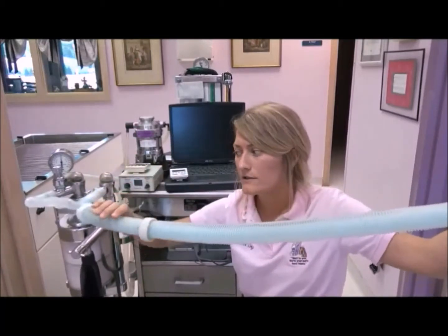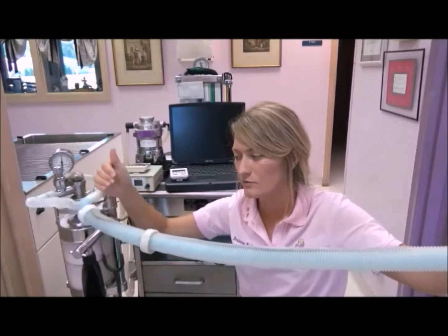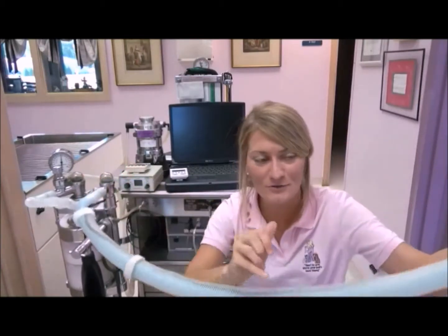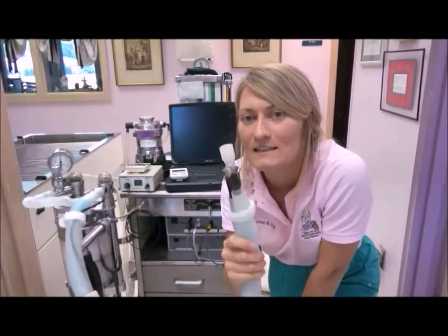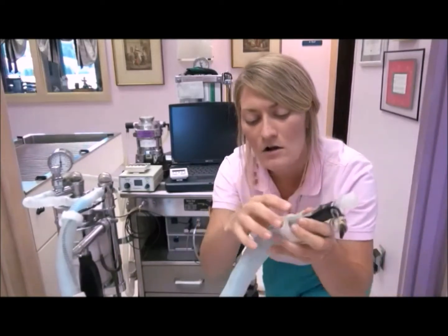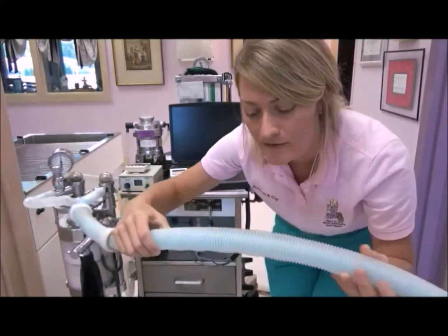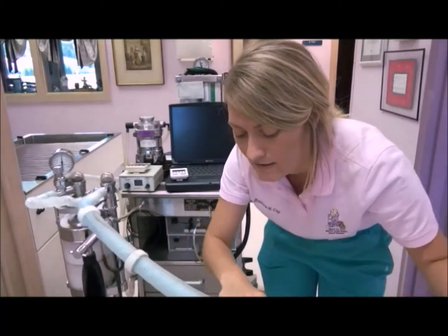And how our tube works is the inspiratory breath brings the gas and oxygen mix through the inner tube, and that travels to the patient. And then once this is hooked up to an ET tube, the patient will inhale it. Once they exhale, the breath will go out through the outer portion of this tube, and that helps to warm up the inspiratory oxygen and anesthetic gas mix.